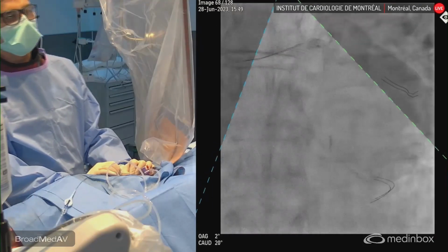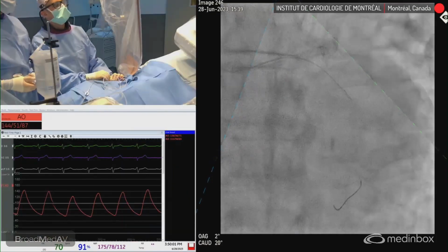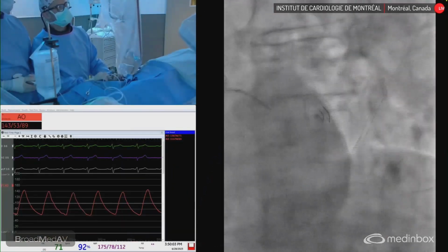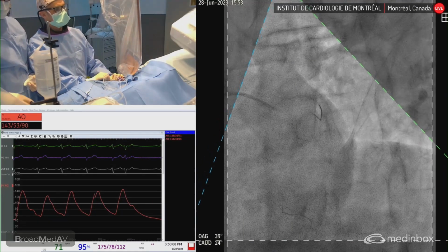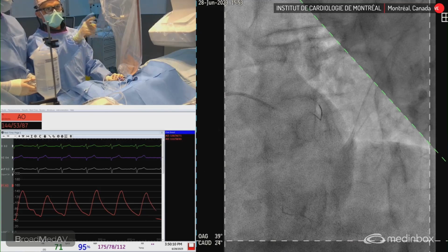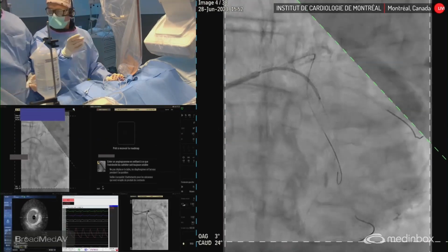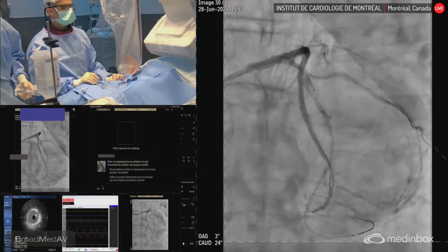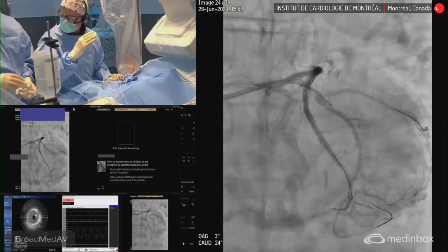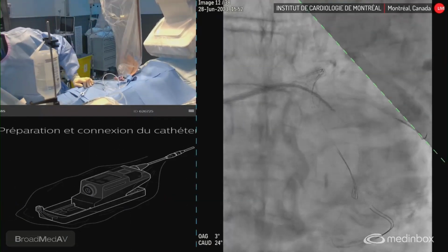Je peux revoir l'angio post-PCI? Ouais, OK. Yeah, c'est ce que je veux dire. Bon, non, reviens en 25? AP20, ouais, AP20, comme tantôt. Fais le checkmark. Non, fais exactement le roadmap. Qu'est-ce que tu fais? Remets-toi en 24. Alors, reviens en 24. Plus de AP. OK, check. Excuse-moi. No, it's okay.